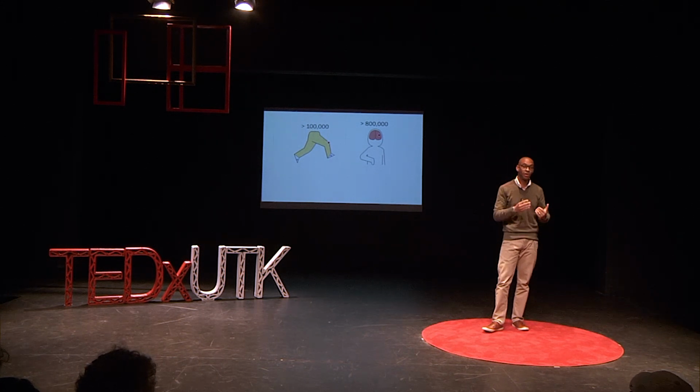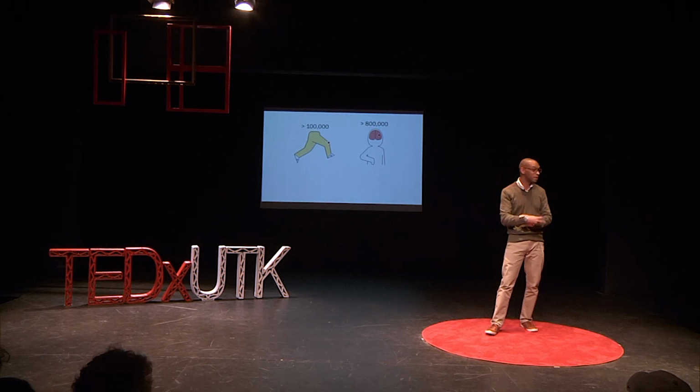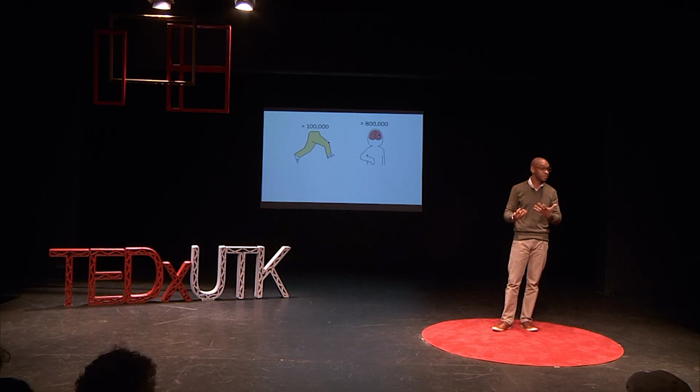Quality of life changes. There are all of these other additional comorbidities or other medical problems that can result from simply not getting increased practice with that limb. So if we can monitor how people are using that limb and encourage them to use that limb, again, in the home setting, that can make a drastic difference in people's lives.